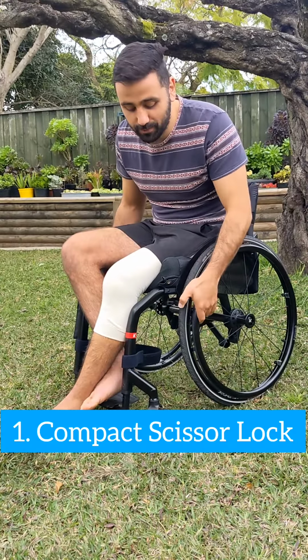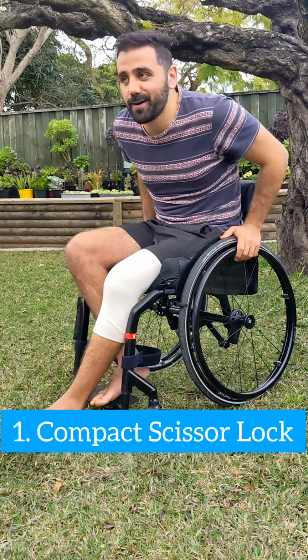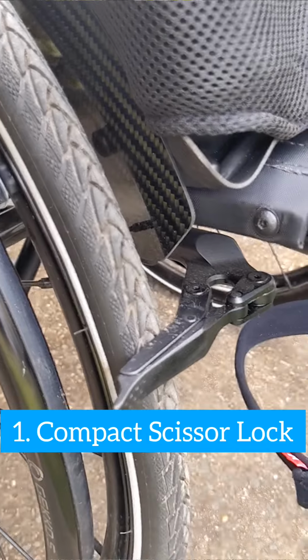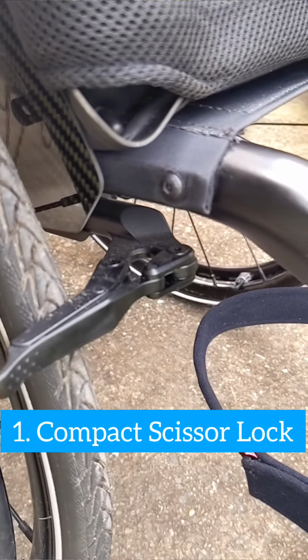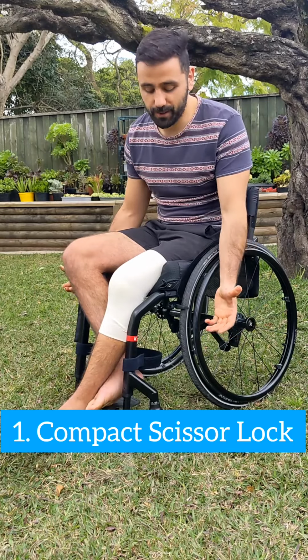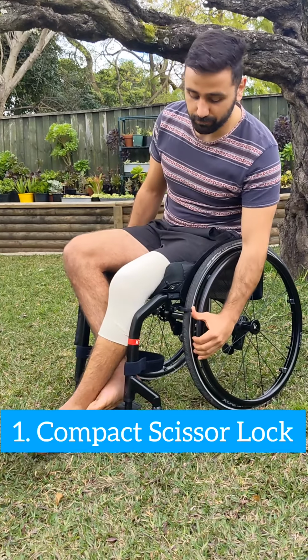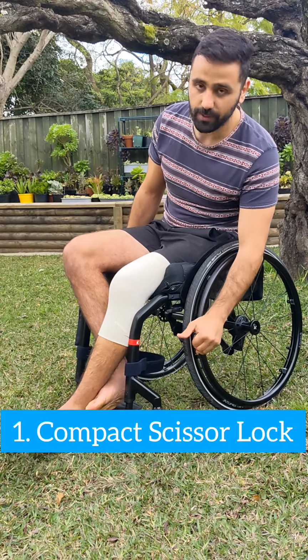Compact scissor locks are probably the most misunderstood brakes on the market. You either love them or hate them, and I think people hate them because when you try to take them off, they're incredibly hard to take off, but only if you do it the wrong way. So I find that for people that are in the chair, as long as they bring that angle of push to a lower position, they're really easy to come off.